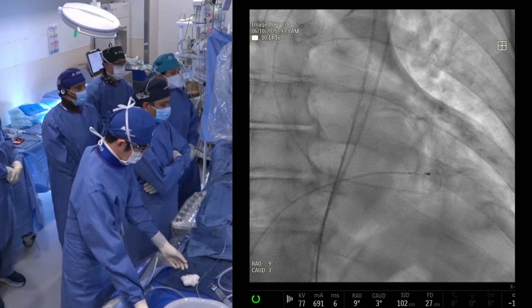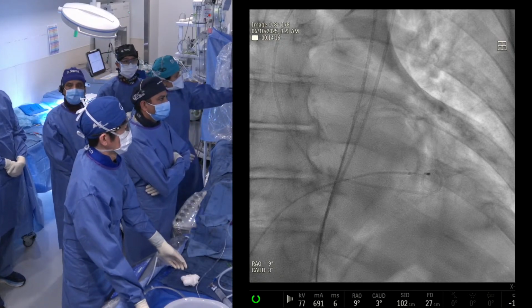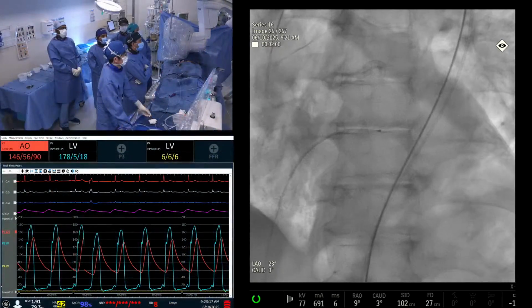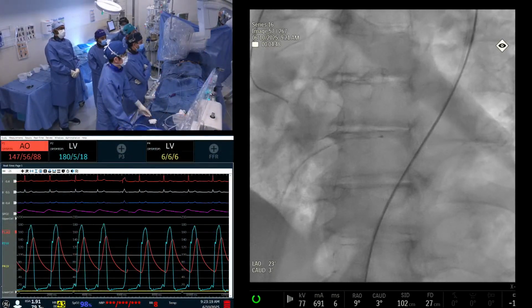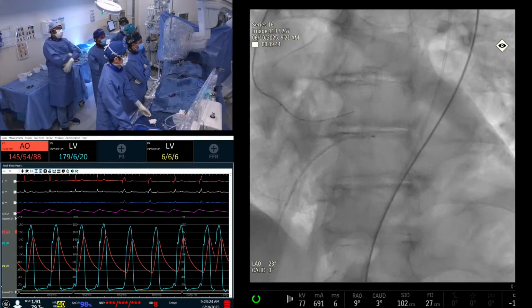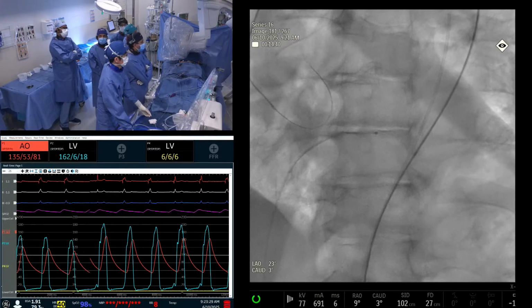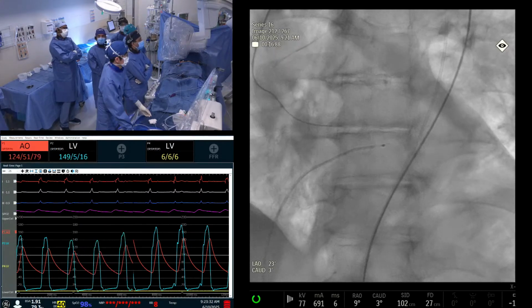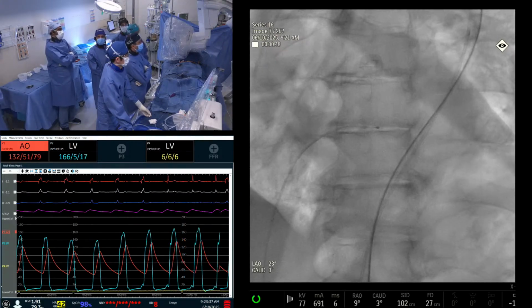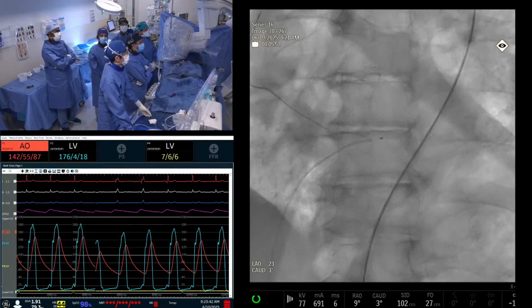All right, Anu, tell us where are we now? Show the hemodynamics, please. Now we cross the valve. We try here to show you AR2, and you see the opening right there. Good. So that's done, and this is the gradient we have at the pigtail.